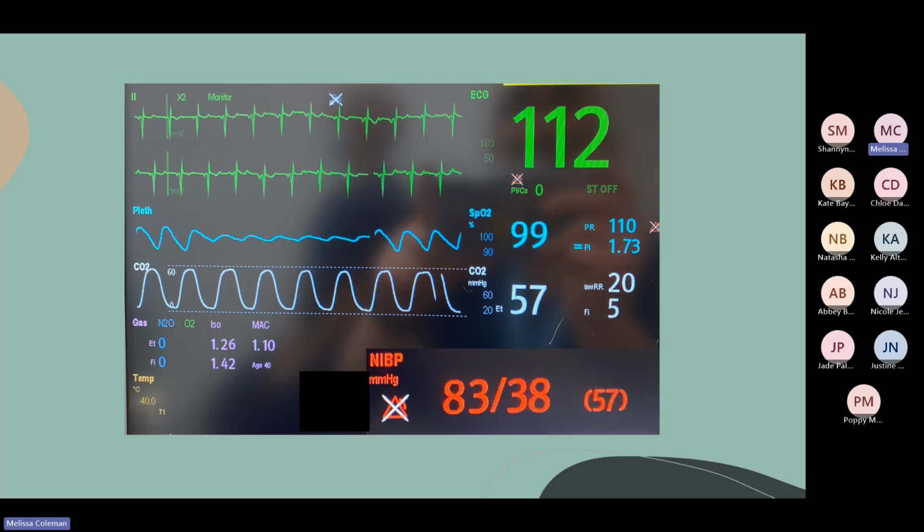Yeah, we could do fluid. The only thing that would stop me from doing fluid currently is that it was very responsive to the ISO. With all of the drugs and things that we've got on board, I would turn down even more. So we'll turn down to 1.25.